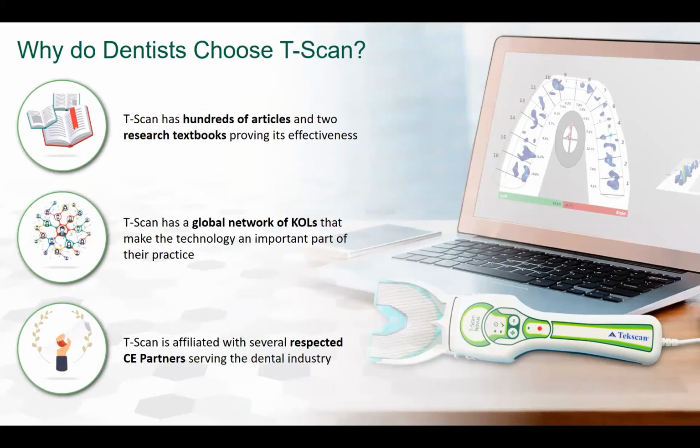First and foremost, T-Scan has been heavily researched over the years. It's something that we've focused heavily on as well. Our bibliography contains hundreds of articles referencing T-Scan. There are 2 full research handbooks that are solely focused on T-Scan and its many applications.